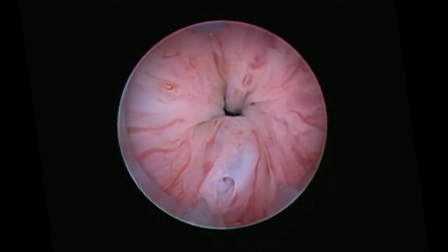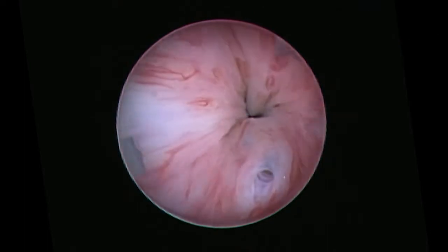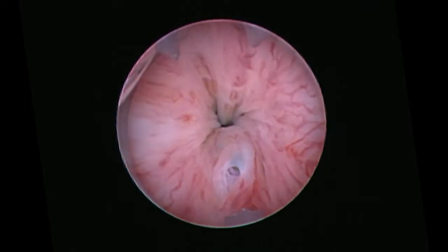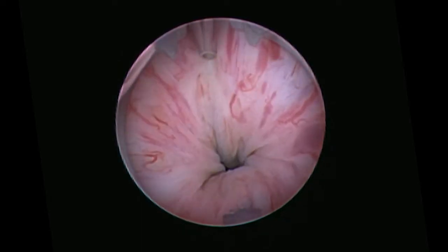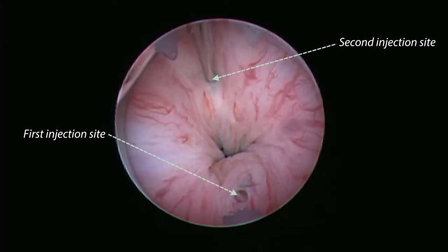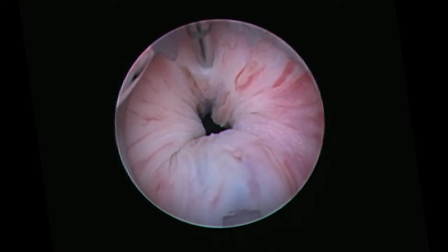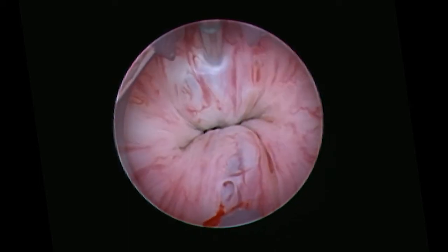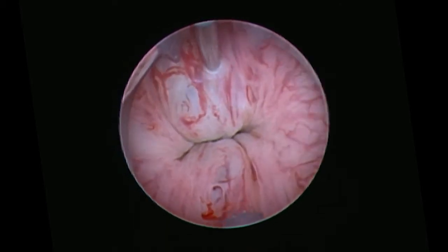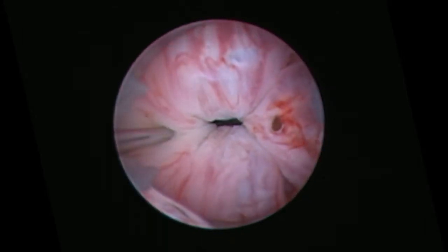To avoid overfilling the bladder and causing discomfort to the patient, close the water inflow and open the outflow between injections. Hold the Bulkamid system in place, only rotating the sheath to the next location while maintaining the level of the Bulkamid system in the urethra. To ensure all injections are placed at the same level in the urethral wall, the first injection site may be used as a guide for the level of the second and subsequent injection sites. This injection procedure is then repeated until 3 or 4 Bulkamid cushions are placed and urethral coaptation is achieved.